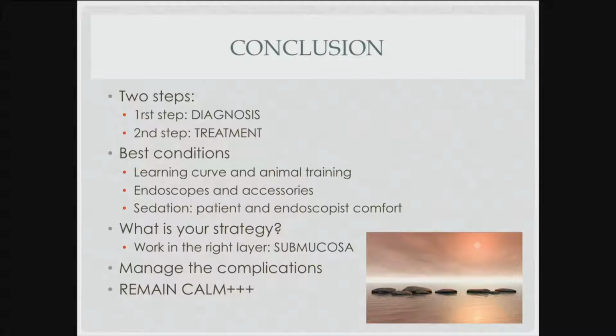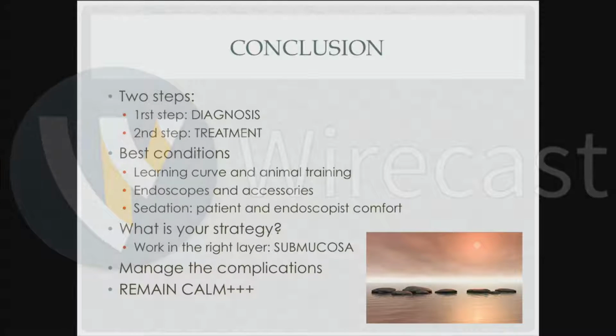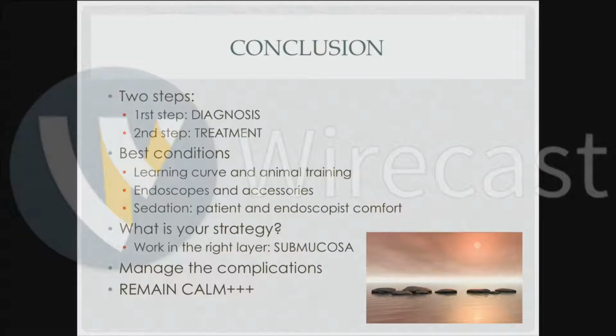But excuse me, the other substitution is the eye drop solution. I've tried actually methyl cellulose in the past, but the problem is that it comes only in tiny bottles, small bottles. And the problem I found with methyl cellulose is it causes pain, especially when you use it in the stomach and in the esophagus, they get pain half an hour, 1 hour later, and you wonder, is this a perforation or is it something else? But with Gelafusin, no such issues at all, and it seems to work very well, and it really lasts a long time.